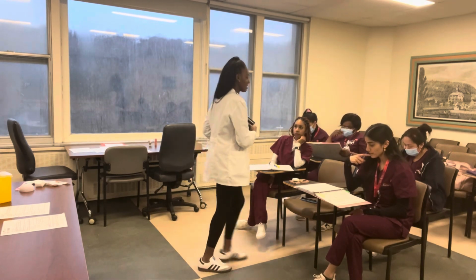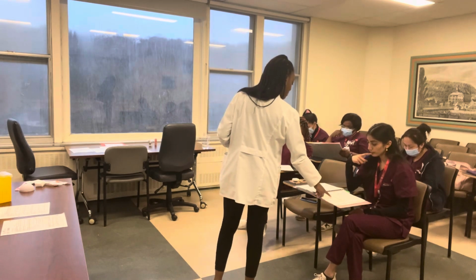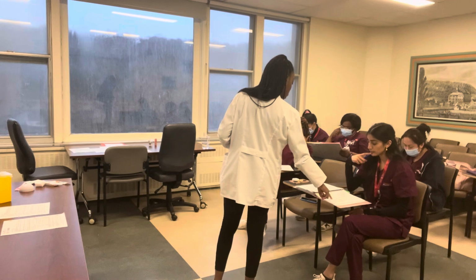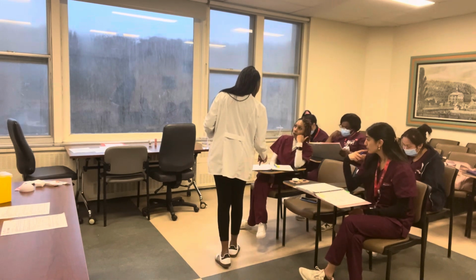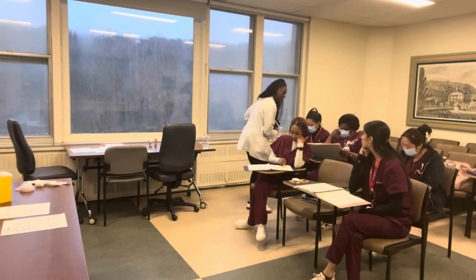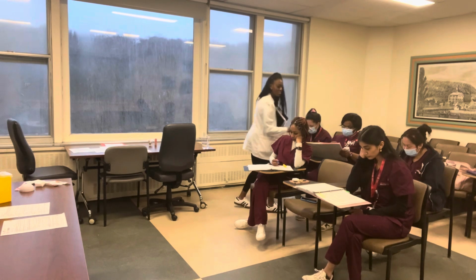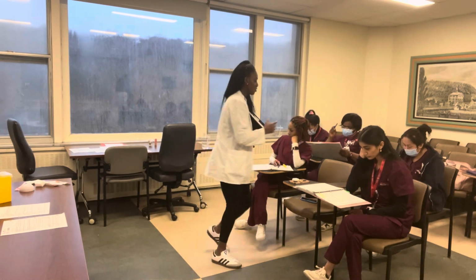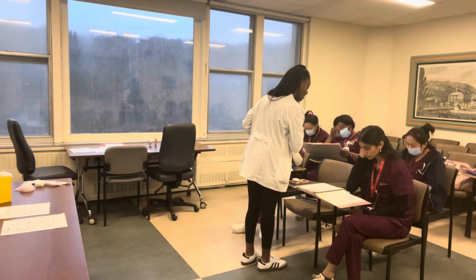The second type of insulin, it says is what? It doesn't say Lantus. It tells you the number first. How much? 14 units. 14 units of? Lantus. Beautiful. Show me. So you start with here, and then you show me the type of insulin. Perfect. And then show me with your pen. 14 of? Show me where the Lantus is.